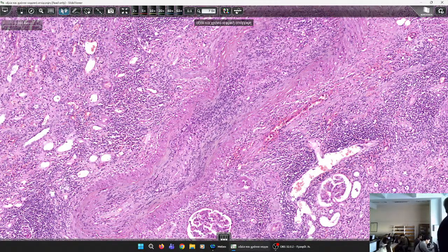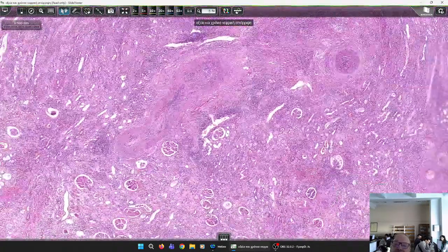And by the way, which subtype of lymphocytes do you expect to predominate in the rejection response? Which type of lymphocytes? T cells of which subpopulation? Cytotoxic cells, yes. T8, CD8 lymphocytes. Okay, now, this is vasculitis.